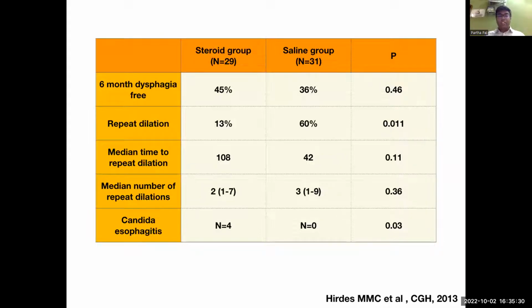Instead, there was increased incidence of candida esophagitis in the group where the steroid injection was used. So it should be used cautiously and meticulously and not in each patient, because that is not without complications. But in our practice, I have not seen much of this candida esophagitis, and mostly this is safe only, but this should be kept in mind.